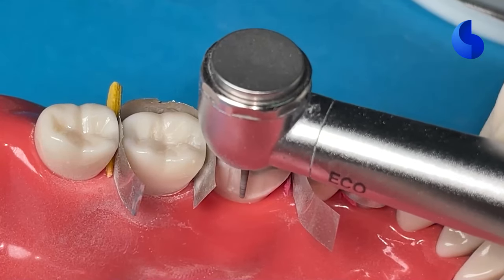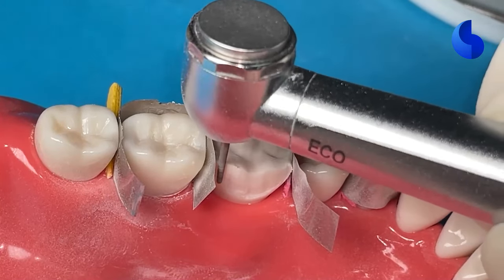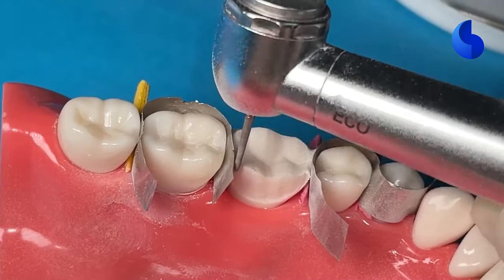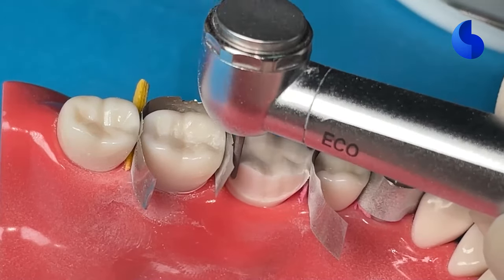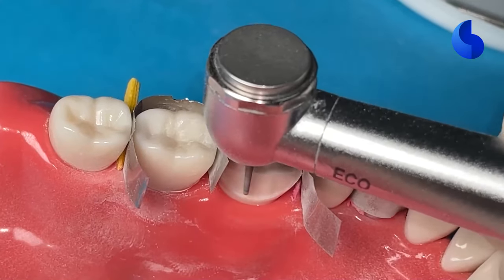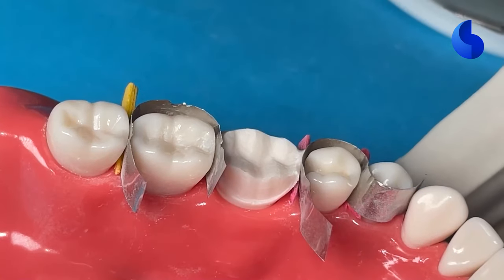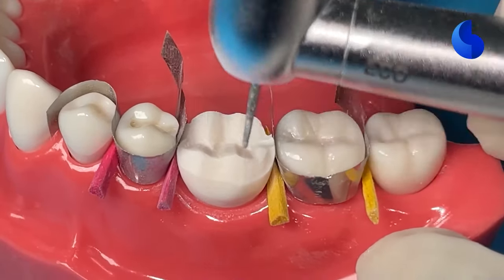And in this, we're using a technique where we're preparing one half of the tooth surface and then moving to the next surface. So as you can see, we're staying quite a ways away from the gingival margin because we want to keep the finish line about 0.5 millimeters supragingival, which is ideal for tooth preparations such as these on a typodont. So if you're somebody who struggles with that, always give yourself some wiggle room. So when you start the preparation, keep it about a millimeter supragingival. And as you go on to finish the prep, you can take the margin down so that its eventual position is about 0.5 millimeters. And you don't have to tip the burr, just keep it parallel to the tooth structure.